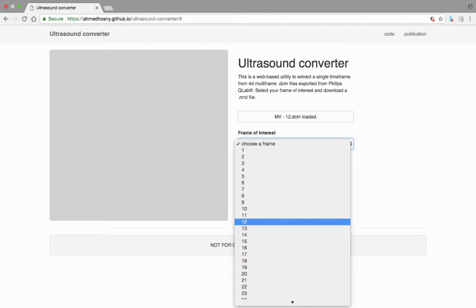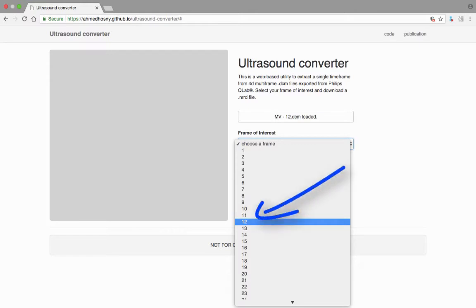When using Philips datasets in the Q-Lab software, you can find the frame number using the Stop Play buttons and panning to the point in time in which you are interested. The numbers will be listed on the screen near the Stop Play buttons towards the bottom of the screen. Select your desired frame from the drop-down menu.